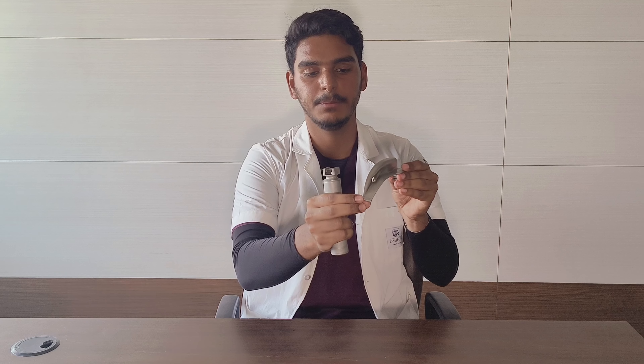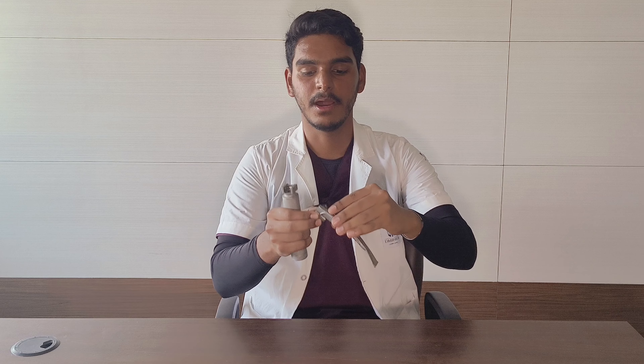And this is the tongue of the blade. This is the tip of the laryngoscope. And there is a stock — this stock fits in the bar of the laryngoscope. There is one lead which gets attached to the lead of the bar, which evokes this light. This is the light source. So these were the parts of the laryngoscope.